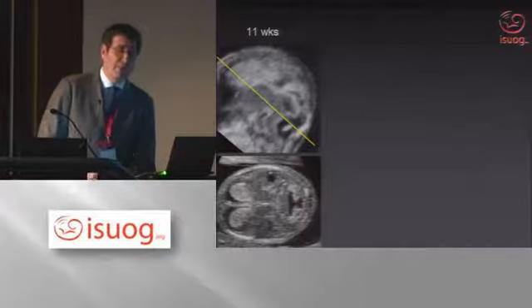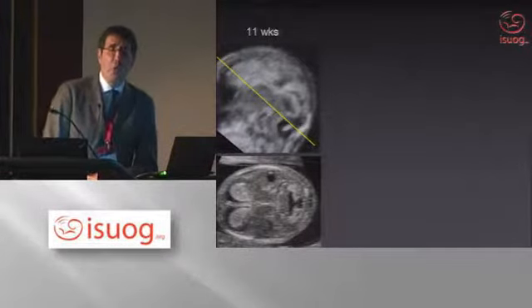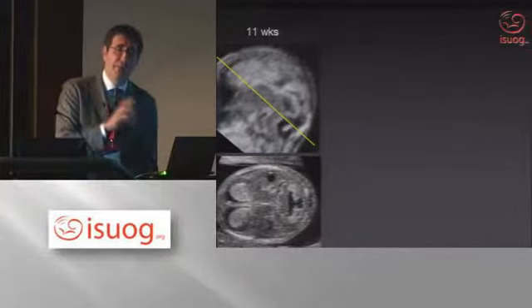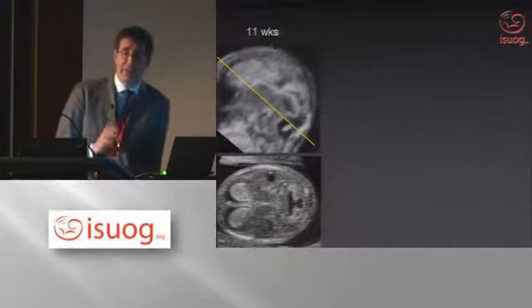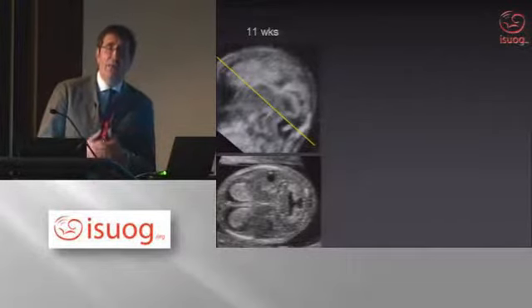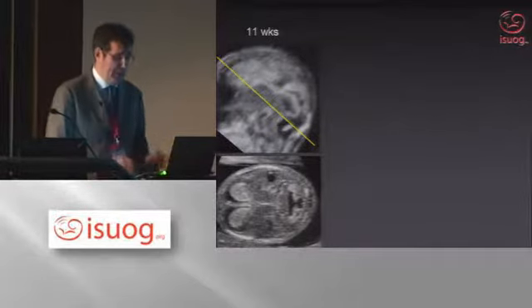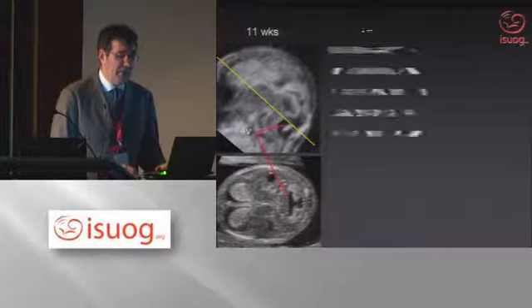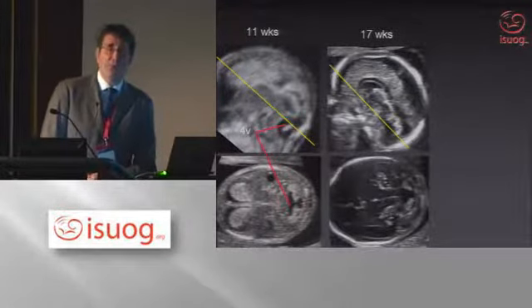If you do an axial plane, you have the impression that the fourth ventricle is widely open posteriorly, as if there was a communication between the cavity of the ventricle and the posterior cisterna magna. Well, in reality, there is no such thing as a cisterna magna right now. It is just the fourth ventricle, which is very big and has not been completely covered by the developing cerebellum, which remains small. And we continue to have a very similar finding, usually up to mid-gestation.